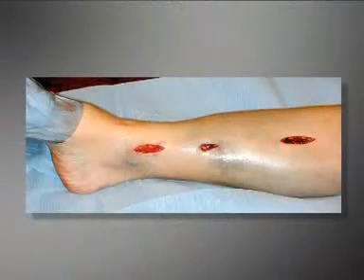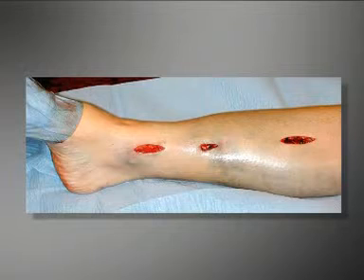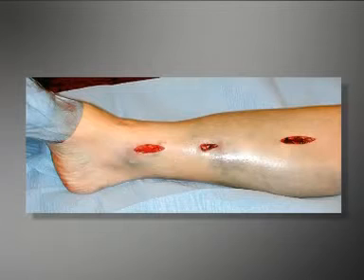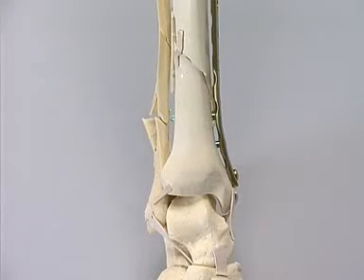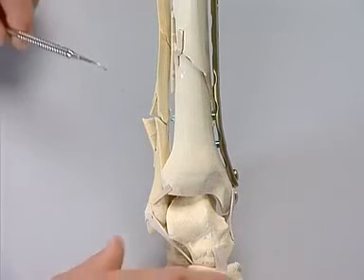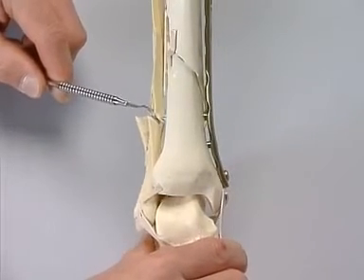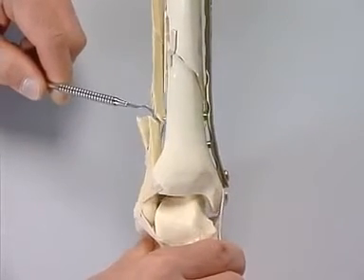Here is the clinical picture after this stage of the operation. In this case, a lag screw was also inserted through the plate to fix a large lateral curved wedge. Fractures of the distal fibula, close to the joint, should be stabilized, because any defective positioning could lead to an incongruence in the upper ankle.